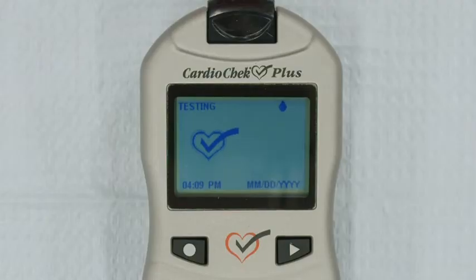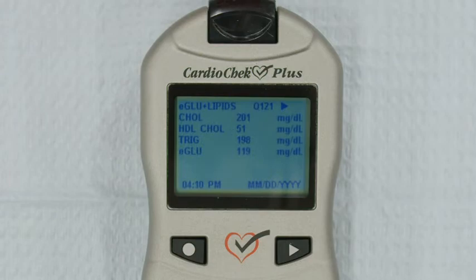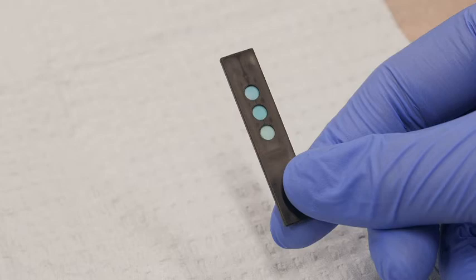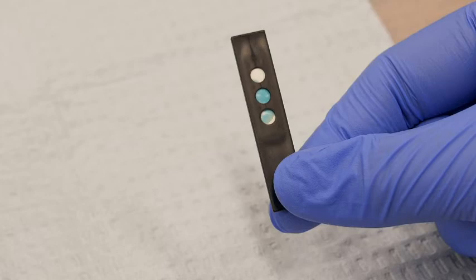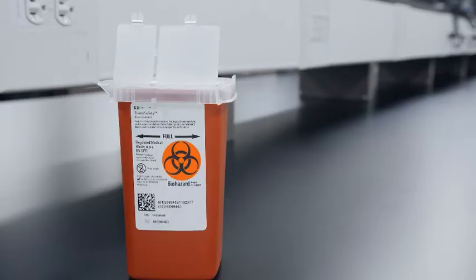Results will appear on your screen in as little as 90 seconds. Once the results are displayed, remove the test strips. Check the back of the lipid panel test strip to make sure that the three circles are completely colored — this indicates that you applied enough blood sample to obtain accurate results. If the circles are not completely colored, you may need to collect another sample and run the test again with new test strips. Once the test is complete, record the results and dispose of the test strips in a biohazard container.